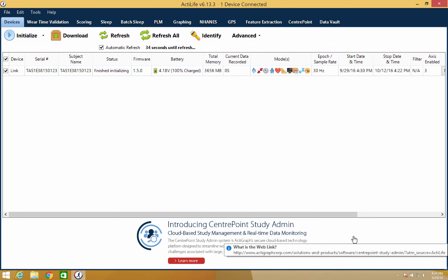This will close the floating window and the progress bar will begin. Once completed, the status will change to finish initializing and the device will begin collecting data as soon as the start time elapses.